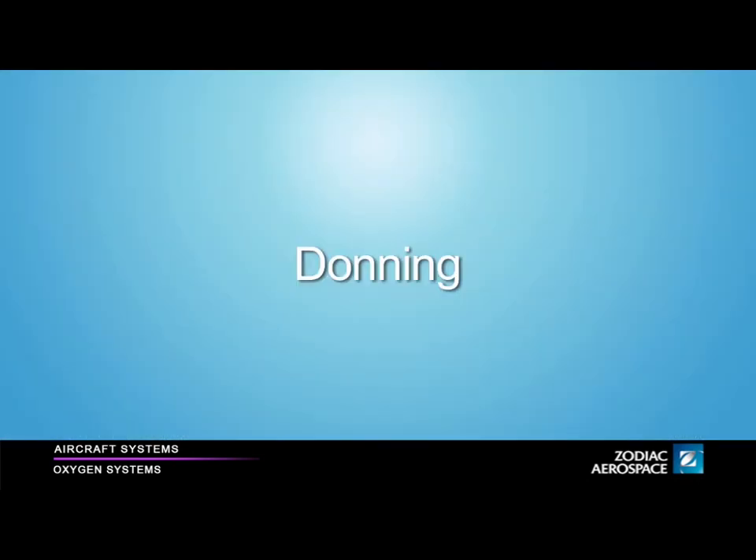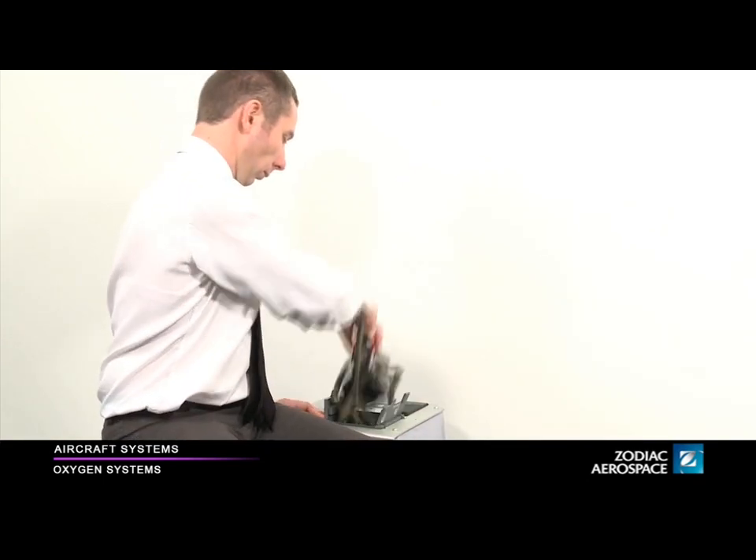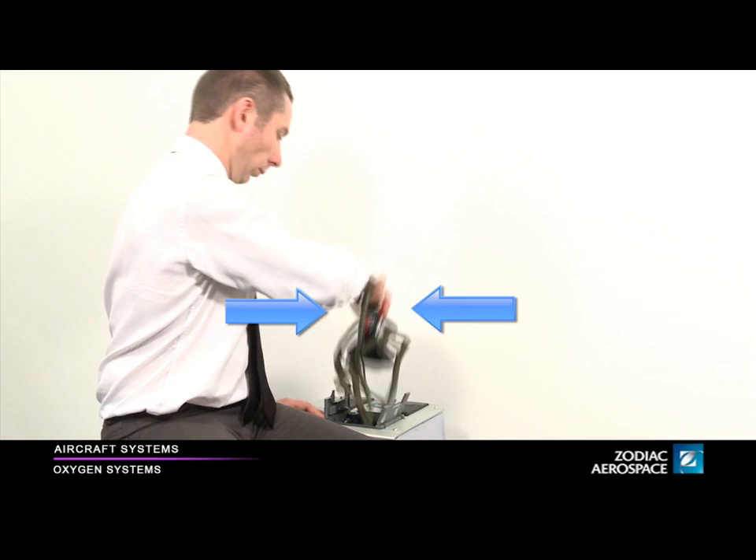Donning. After any use of a mask, always re-stow it in its box, even if it may be necessary to use it again in the same flight. Pull the mask completely out of the box. While you are swinging the mask forward, inflate the harness by pressing and holding down the two red tabs. Put the mask on your head.